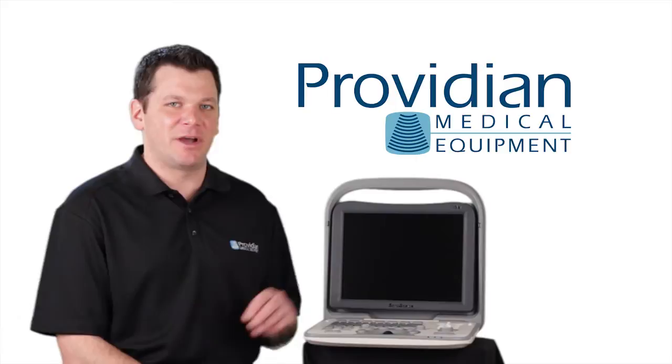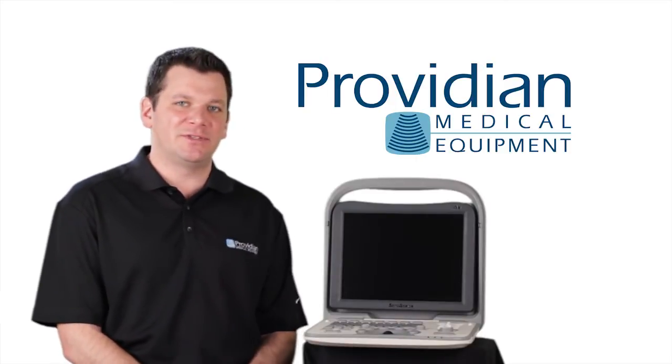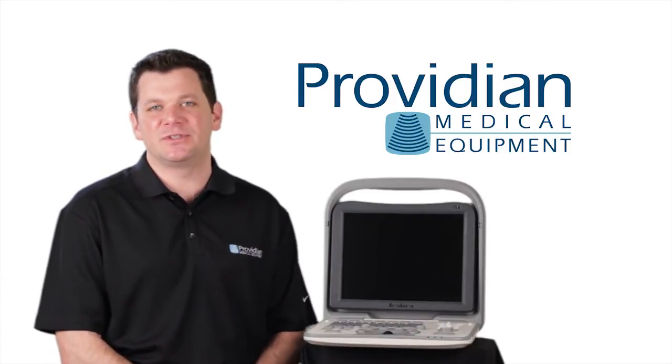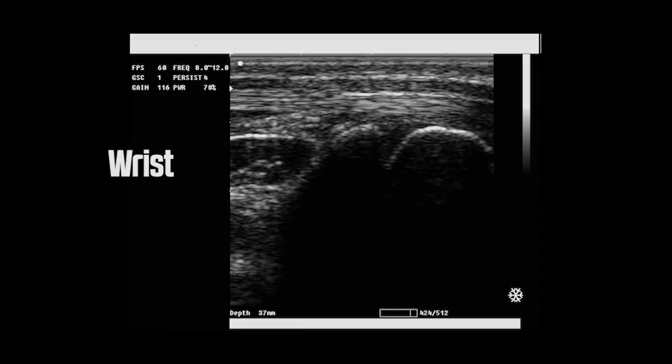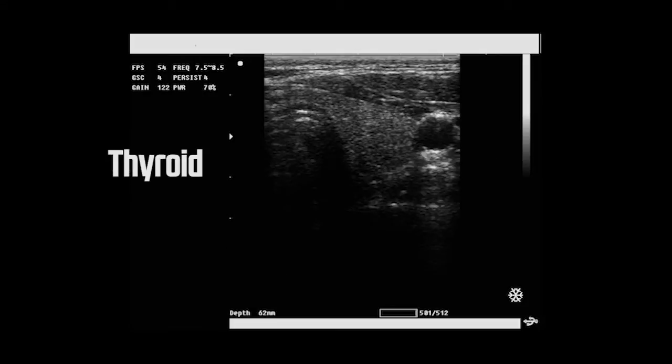Black and white portable ultrasounds have come a long way as far as user interface is concerned. Saving, exporting images, probes that are available for it, calculations and everything overall is so much better on these portable black and white ultrasound machines, and they're still easy to use with a low cost.